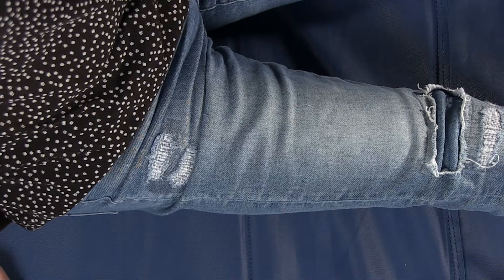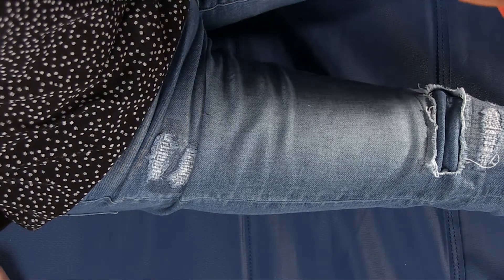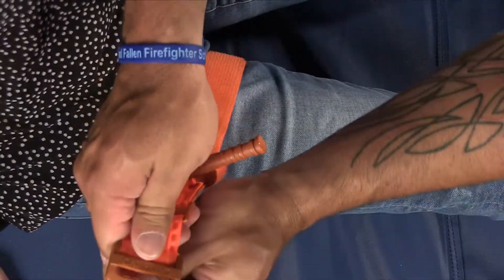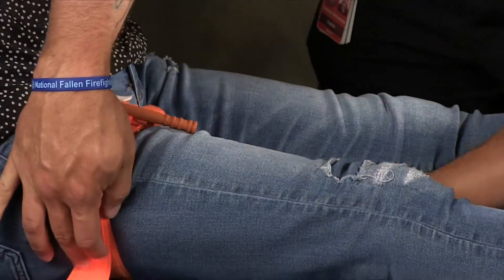To use on a leg, open the tourniquet by removing the band from the friction buckle. Slide the tourniquet under the space behind the knee and then up the leg as high as possible. Wrap the band around the leg and pass the band through the friction buckle, then bring the band back around the leg and pull it tightly.